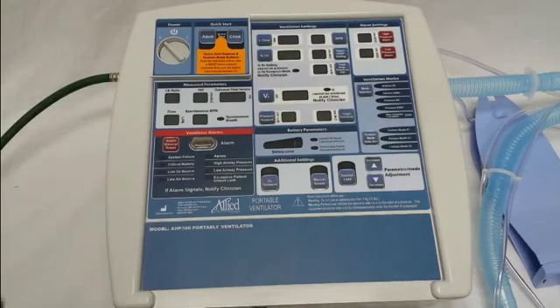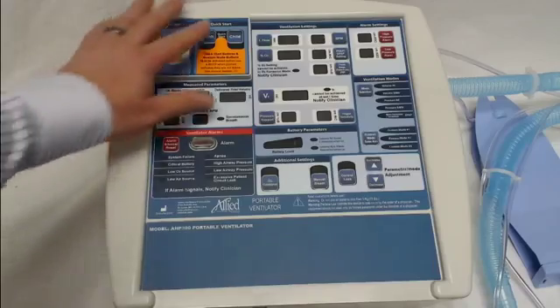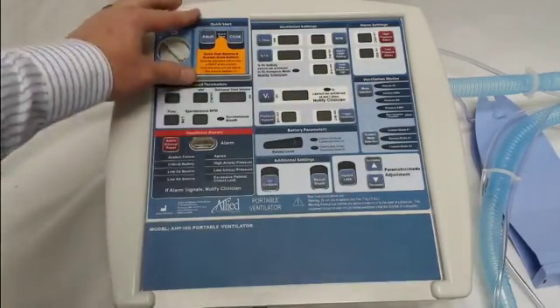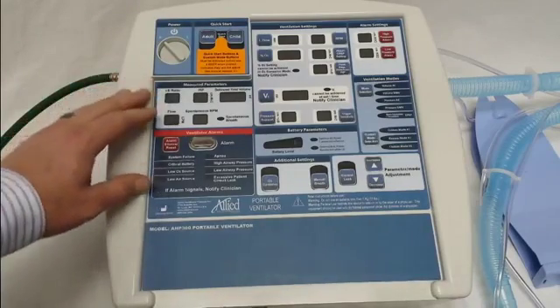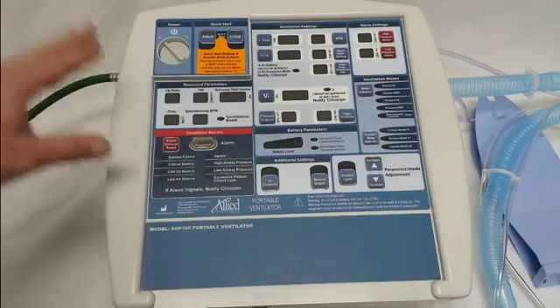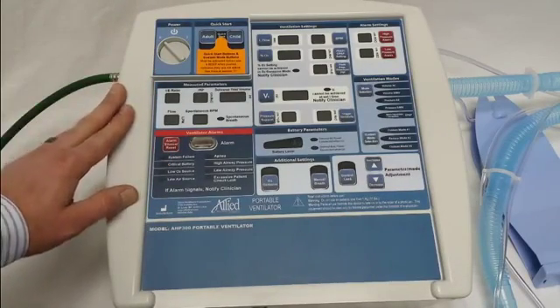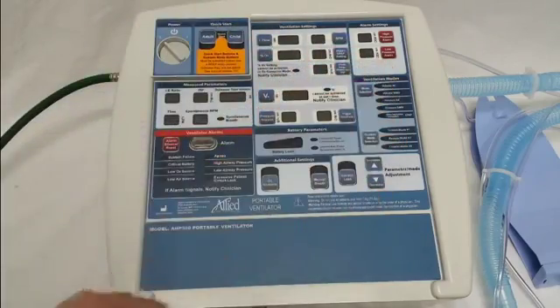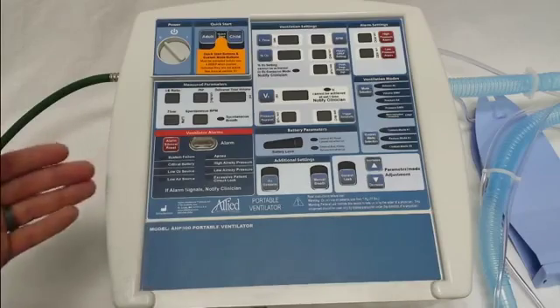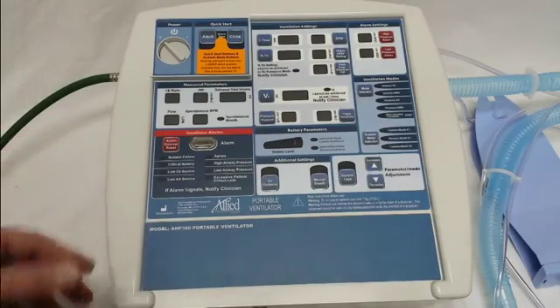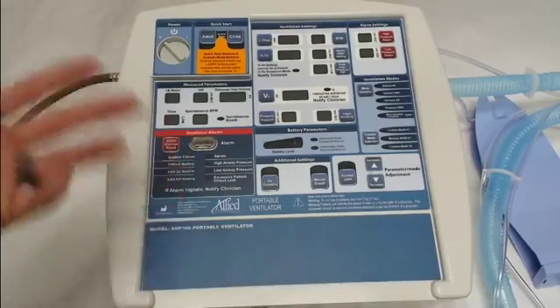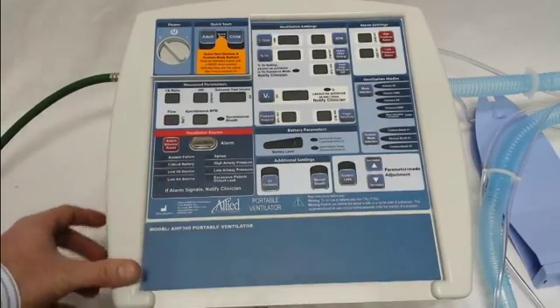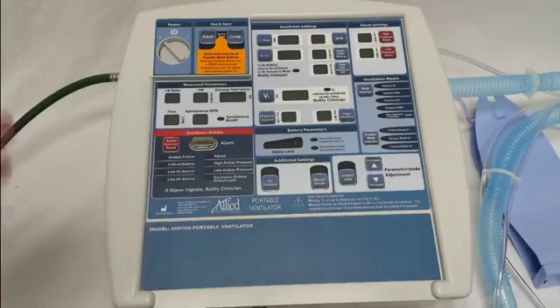When these ventilators are shipped from the company, they come with the quick start and the custom modes locked out. That's because Allied Health Care Products feels it's important that the clinician or the institution set the parameters they want to use for adult, child, and custom modes. This video will show you how to quickly and easily enter the programming mode, set the desired settings, and save them so you're ready to use these quick start modes.